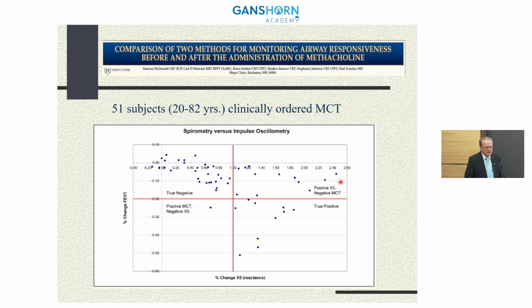This is data that we did within my laboratory, and so we looked at quiet breathing and the response to methacholine. And if you look at the positivity of a test and or being negative, you end up with a group of individuals that were negative to FEV1 in their methacholine response, but positive in their reactance response.